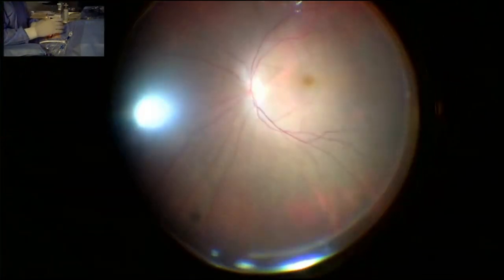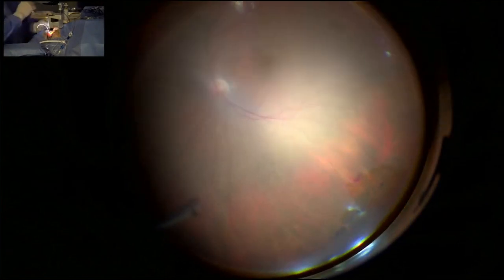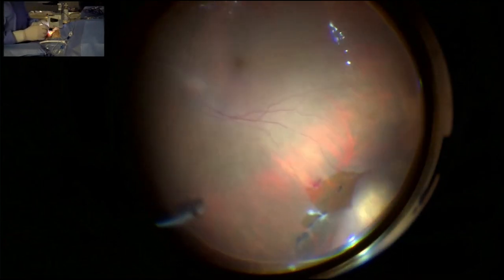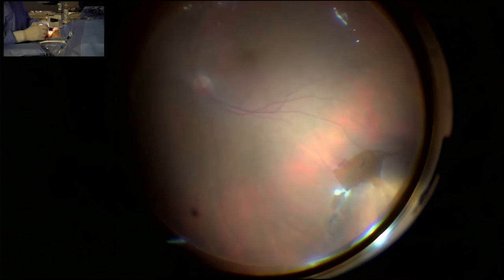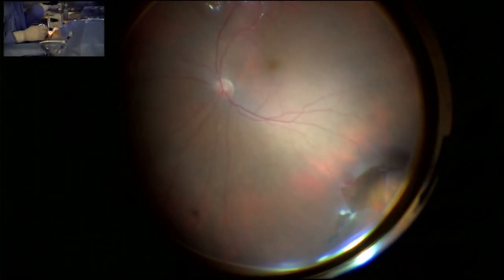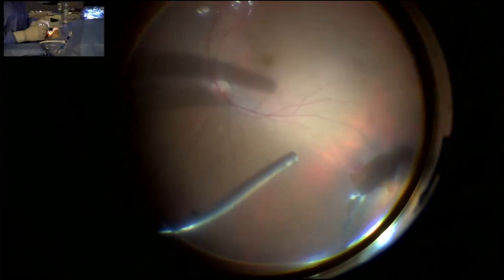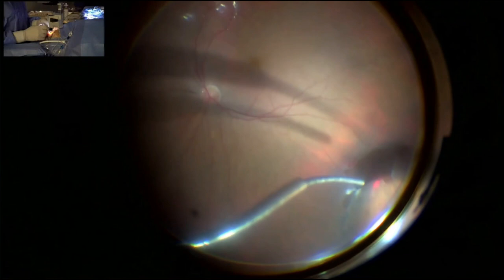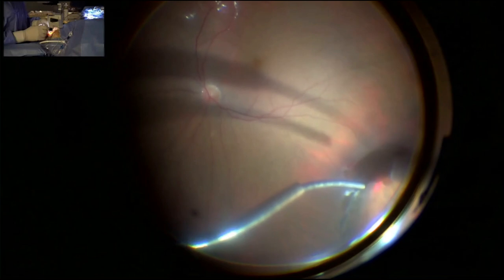You're right. Air tamponade gives a wide angle view, but for this patient, I don't need a wide angle view, I need a sharp view, and it's not sharp enough under air. This is the first reason. As you see here, you can see the retinal tear perfectly for laser. And the second one, the arrangement of laser power under air is not easy, but it's easier and more stable under PFO or under fluid. Therefore, I usually prefer to do laser under PFO, not under air.